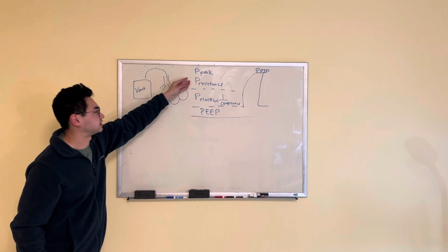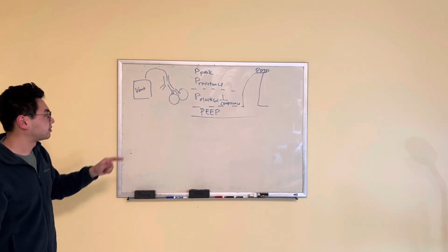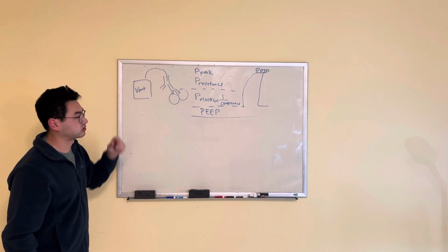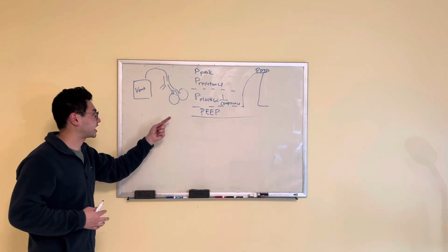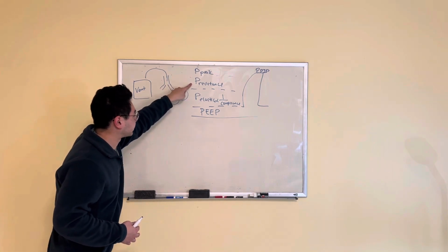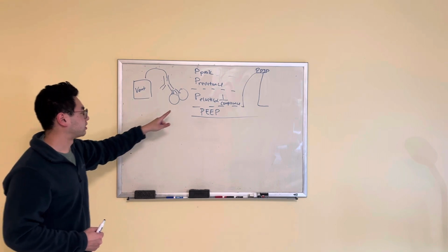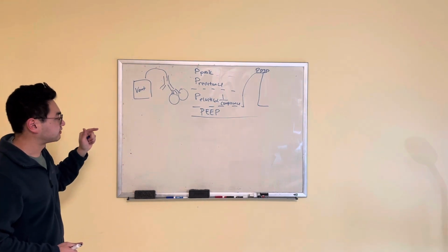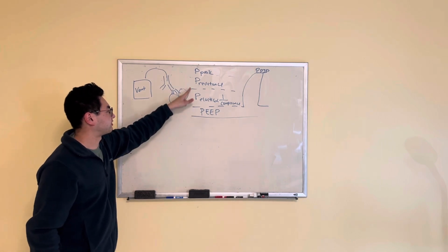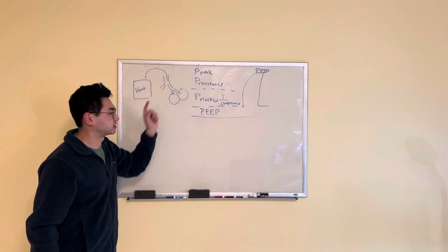It had to give an additional pressure to open up to overcome the resistance, but after you've hit the top, there's no more resistance. What I'm trying to get you to understand is that if we want to calculate the other pressures, we can try to knock one other pressure off. So what we do is an inspiratory hold, and that gives just enough pressure to open up the alveoli and overcome the resistance, which is going to be 0.